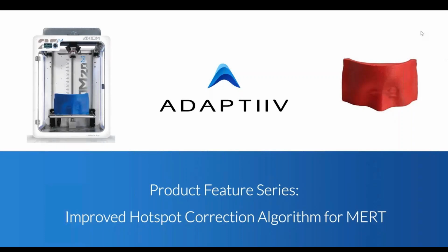Before we go, just note that this webinar is highly specialized, and it's for those folks who are using electron radiotherapy in their practice today. So we do apologize if we go a little deep into the weeds here, but I think that's the intention of this, and we really want to convey the great things that our software can do and help in your treatment plans.